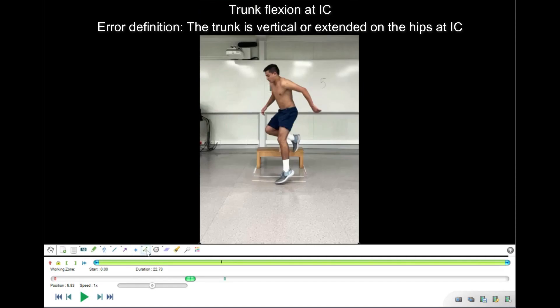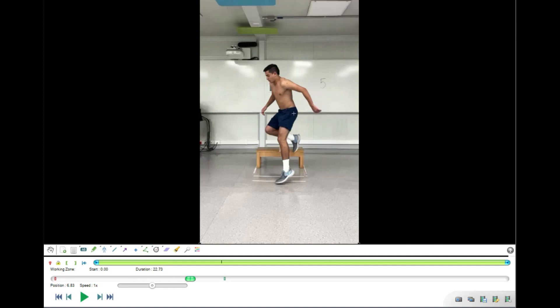The third item is trunk angle at initial contact. I take the angle measure and place the cross on the hip center, close to the greater trochanter, and set 90 degrees — representing how it would look if the trunk were vertical and extended at the hips. I then align the other line parallel to the spine, and we see that the trunk angle at initial contact is 15 degrees, which is more than 0, so no error is scored for this item.